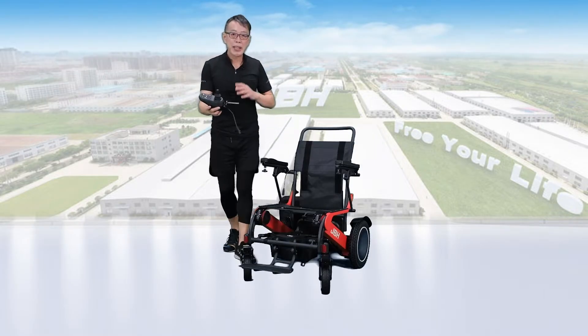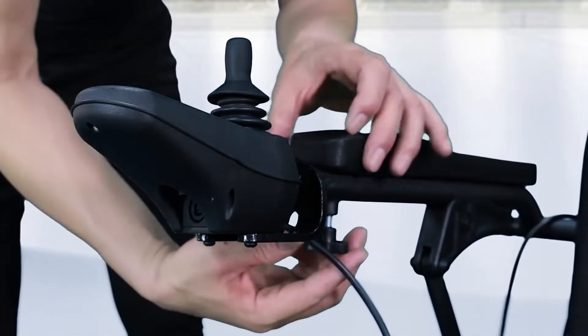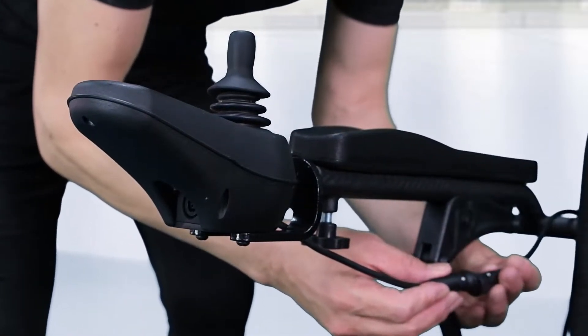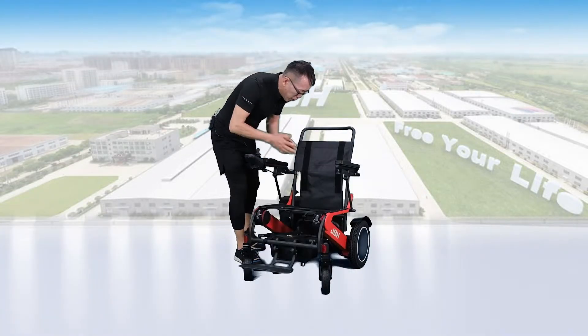First of all, let's take out the controller, then slide it into the pipe on the armrest and tighten the knob — not too tight. Connect the wire. It's all set.